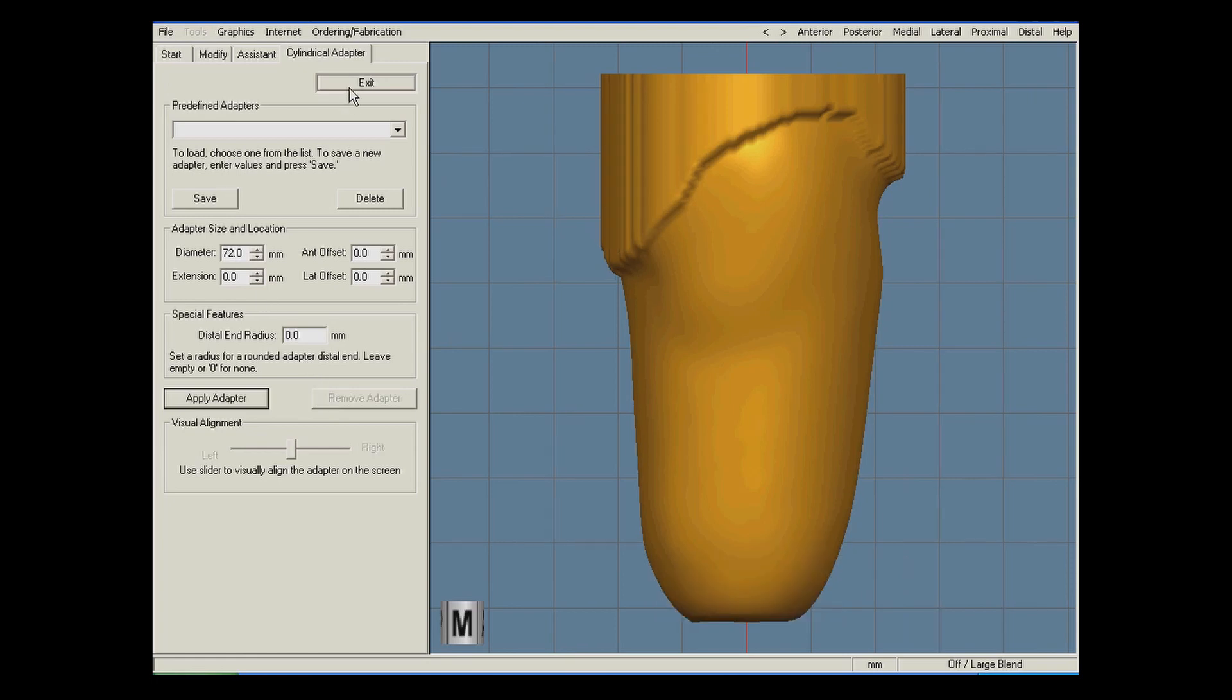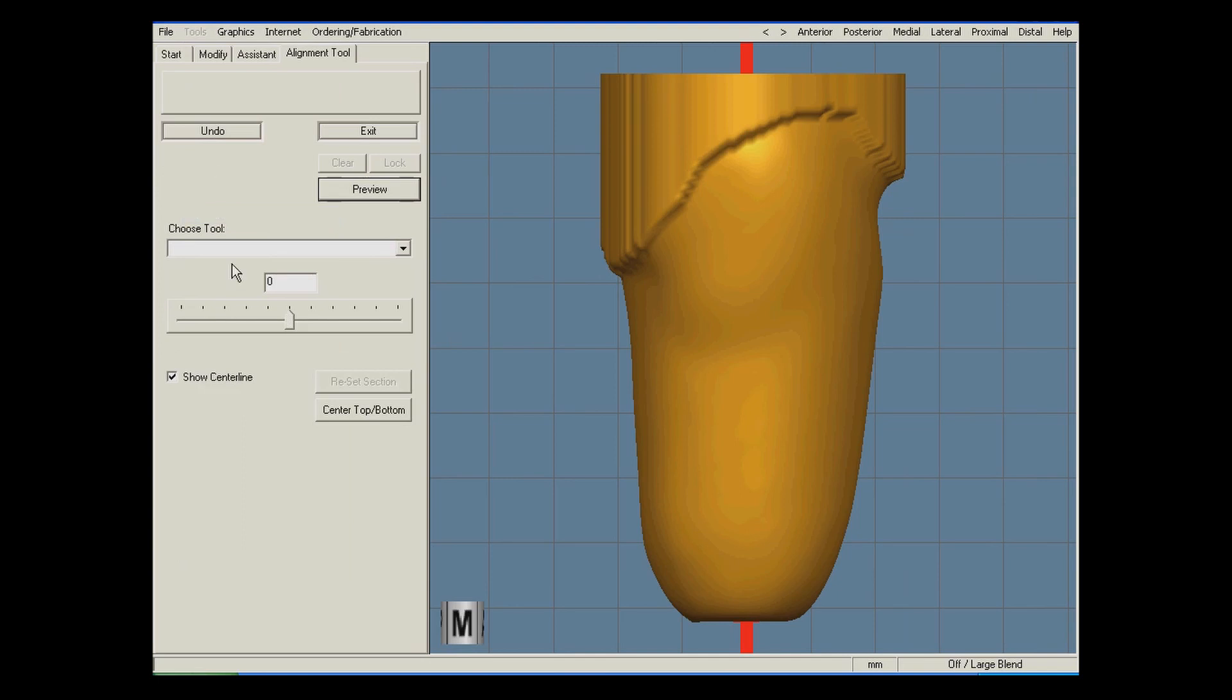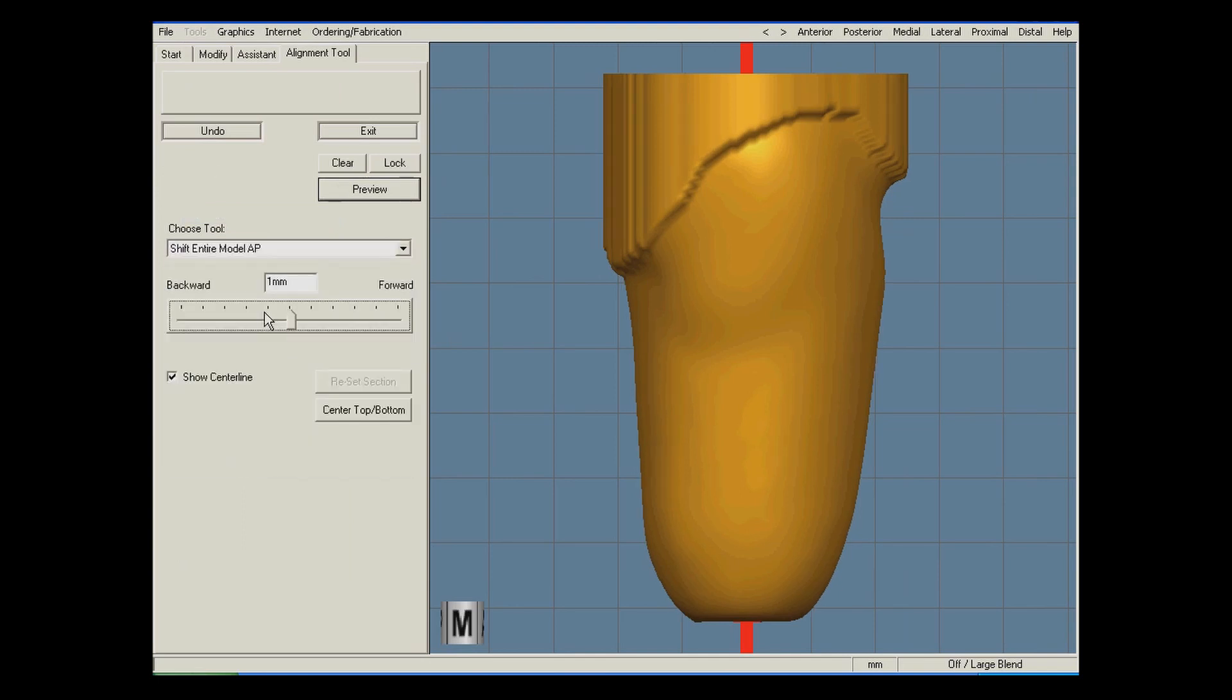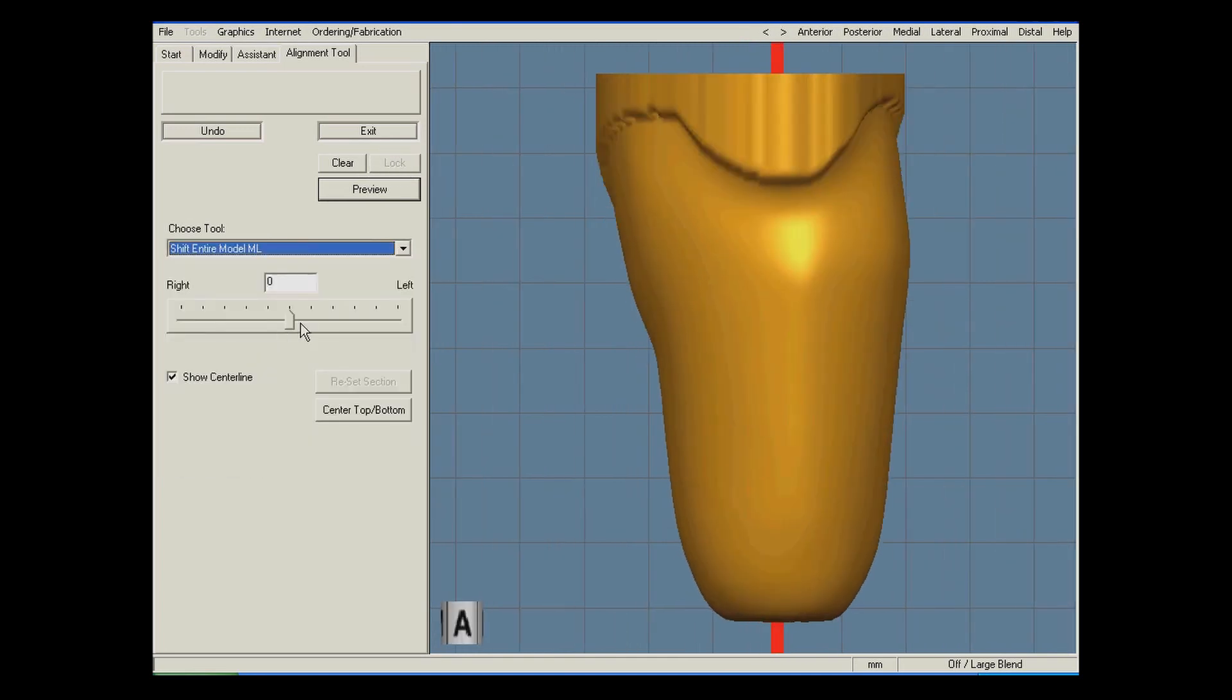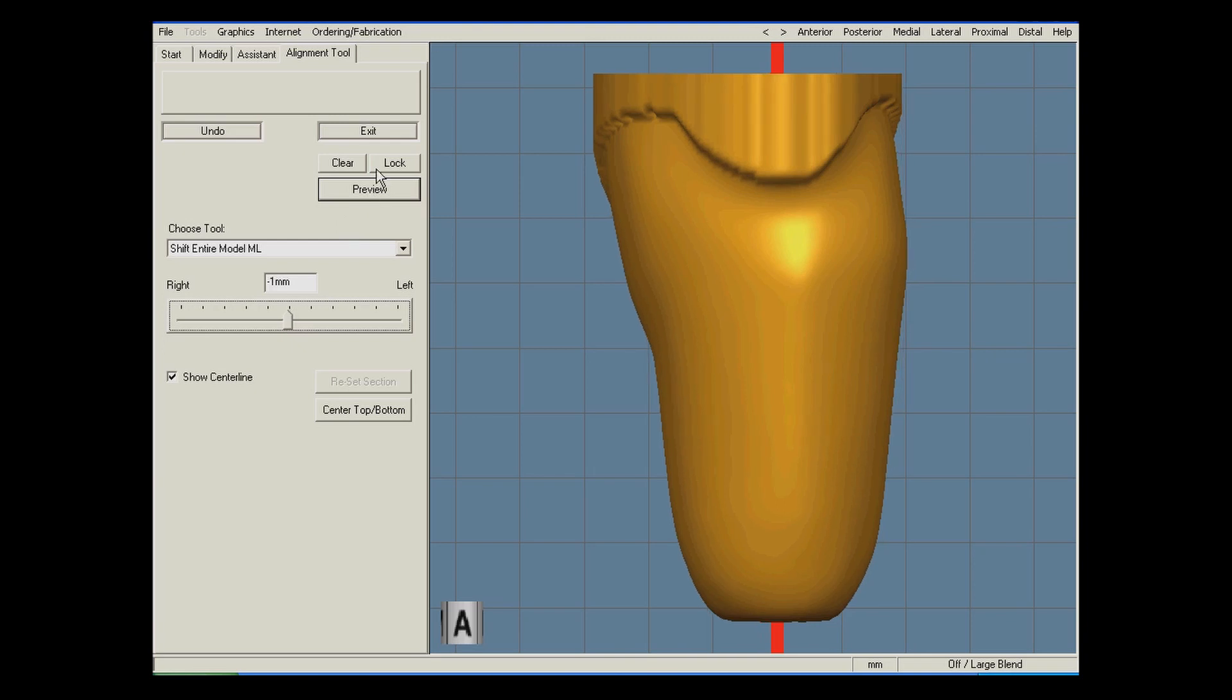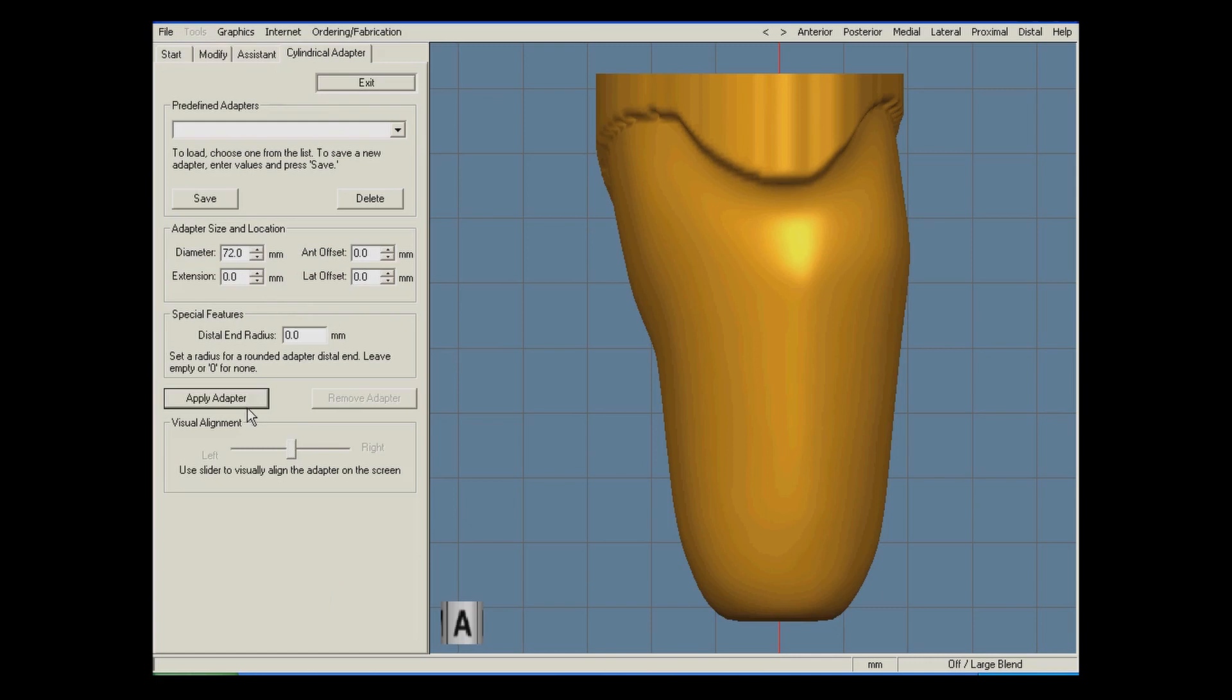I remove the adapter and switch over to the alignment tool, which allows me to shift the entire model in the medial lateral plane to fix the lateral overhang, as well as shift the model in the anterior posterior plane to correct that alignment as well. The alignment looks good, so I reapply the cylindrical adapter.